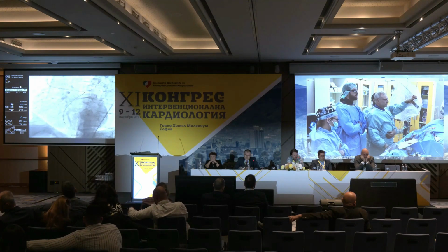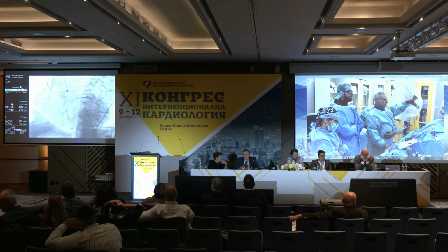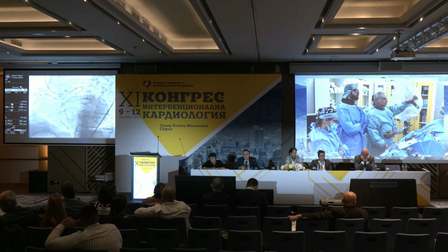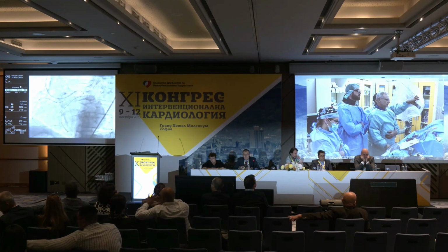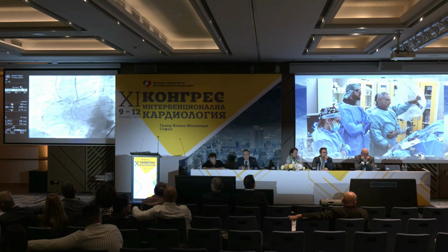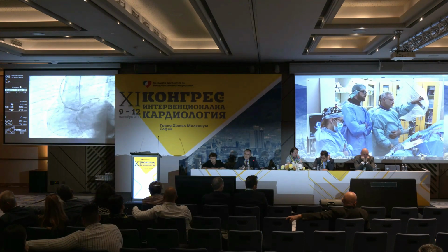Here, it looks like there is a branch that goes down to. No, this is too early now. You see, this was the contrast that was existing from the antegrade wiring. There is contrast there, you can appreciate that. Yes, there is a staining for sure, and it is exactly in the same projection.